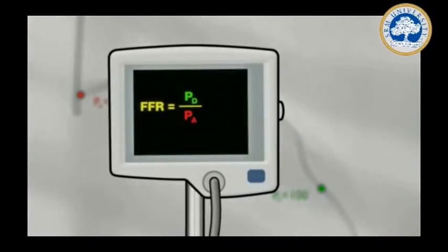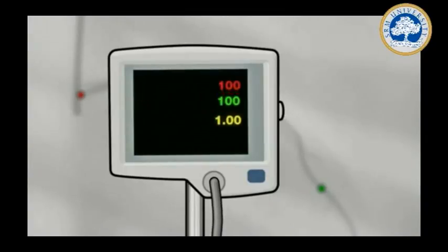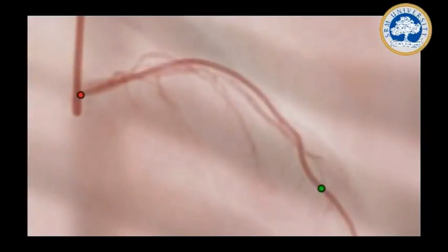Fractional flow reserve, or FFR, is defined as the fraction of maximum achievable blood flow that can still be maintained to the myocardium despite the presence of a stenosis. During maximum hyperemia, FFR can, through a series of simplifications, be calculated as distal pressure, PD, divided by proximal pressure, PA. Let's look at an example.